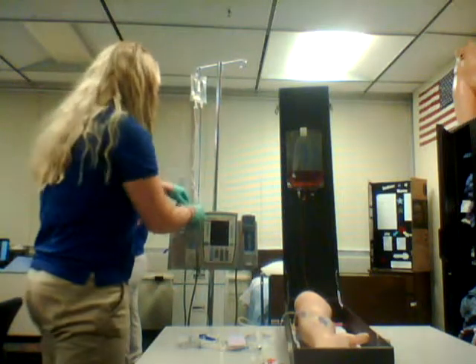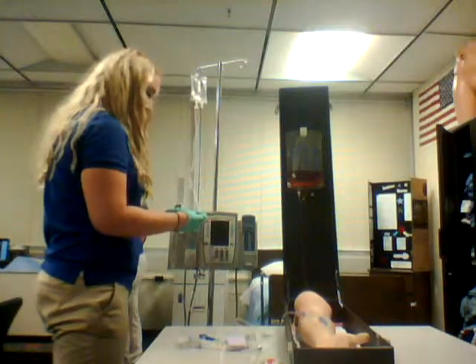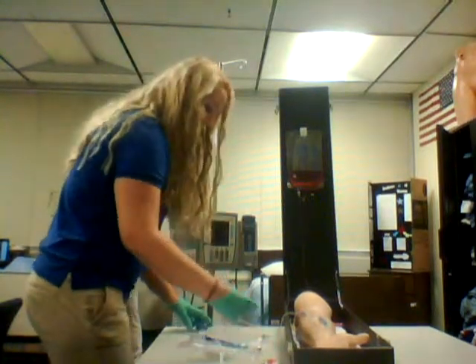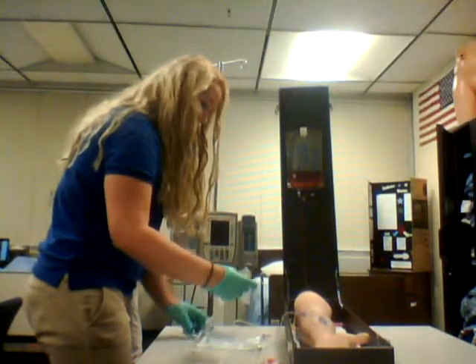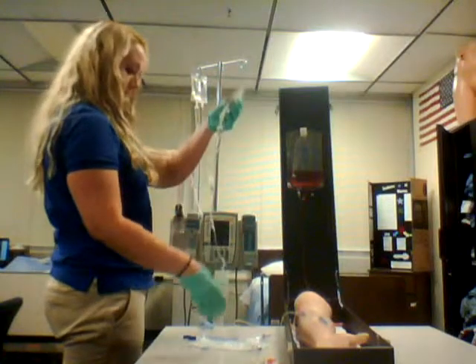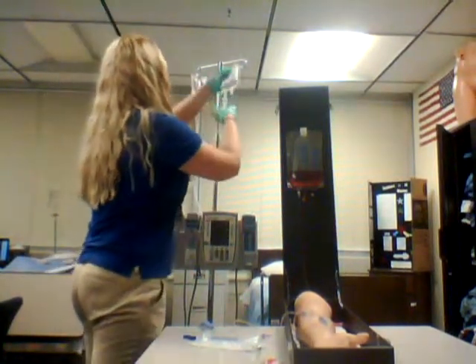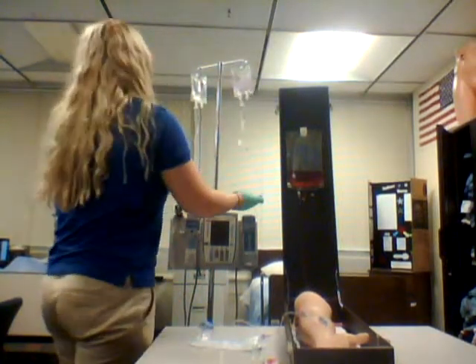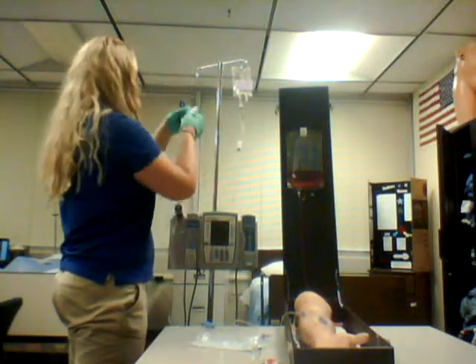I'm going to clamp off my primary tubing that is already here. Line is primed. Now, prior to doing any insertion of anything, I'm going to take an alcohol swab and clean the port of the primary tubing.